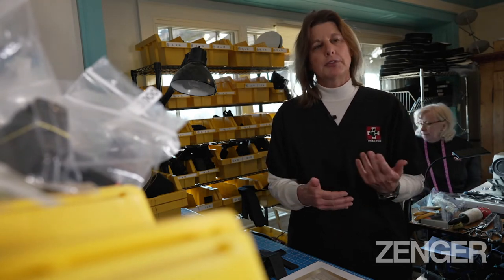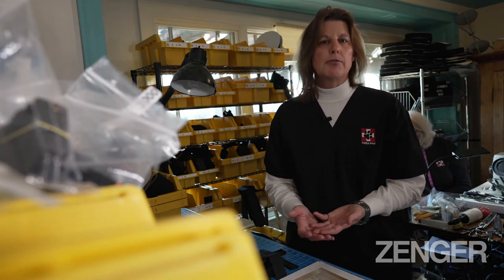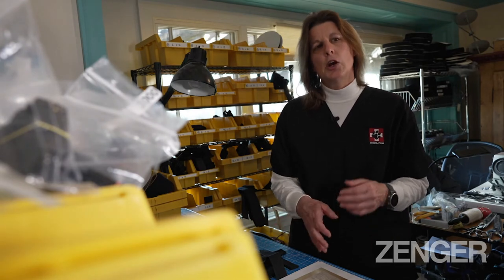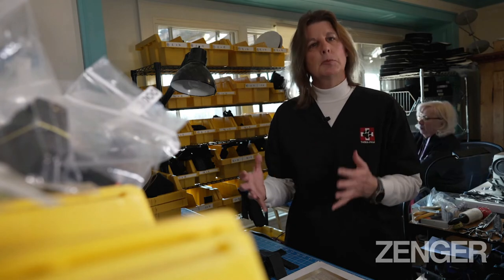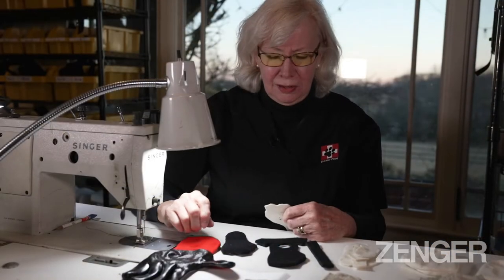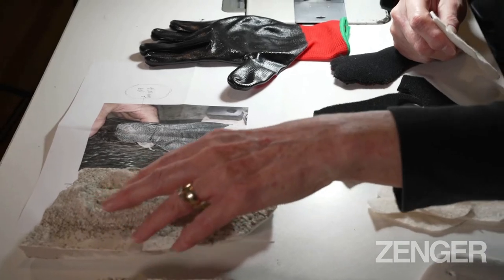Now we have a lot of standard types of leg braces for the front leg and the back leg, for all different kinds of issues — whether your pet has a mild injury like a sprain or strain, or something more serious like even a fracture. We have braces and splints that run the gamut as far as the amount of support provided for the pet. So this is a boot for Lucas's right foot, and this is a mold of his right foot.